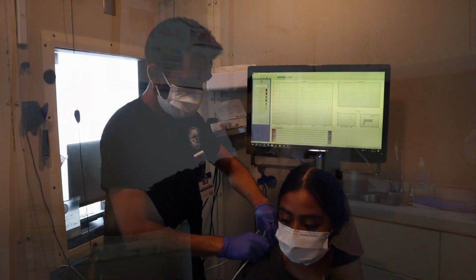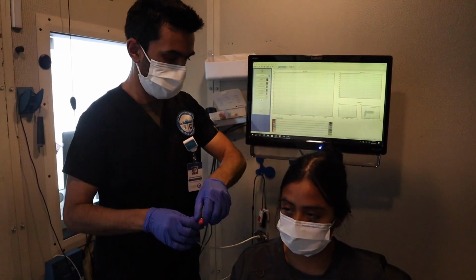The first thing that we do doesn't involve the patient to do anything but just hang out there and let it happen. It's called otoacoustic emissions, also known as OAEs. Otoacoustic emissions are something that happens all the time. Right now, as we're having this conversation, the outer hair cells of my inner ear are producing slight tones that are escaping out to my middle ear space, but no one can hear those tones.